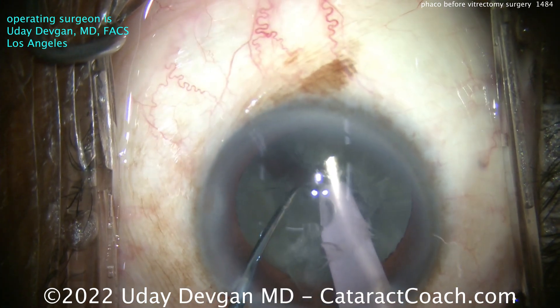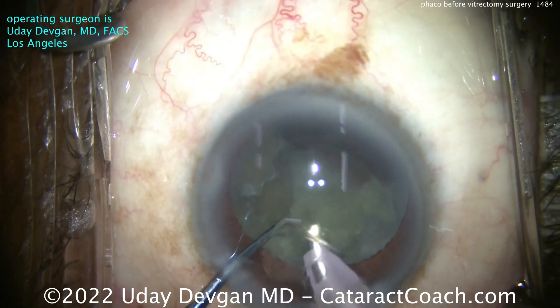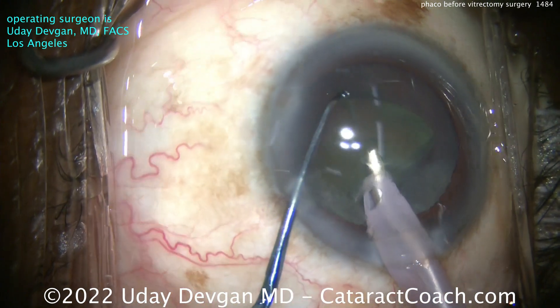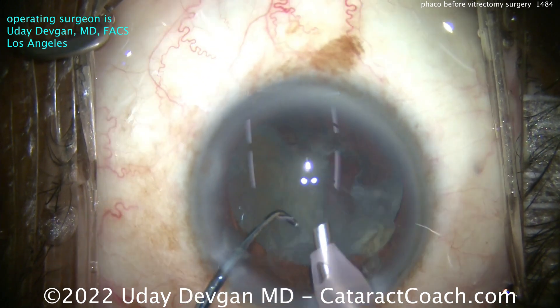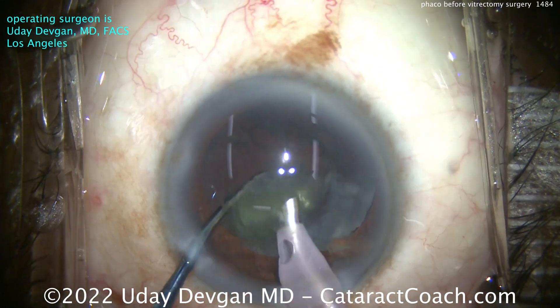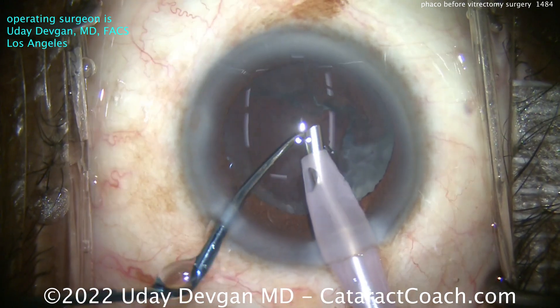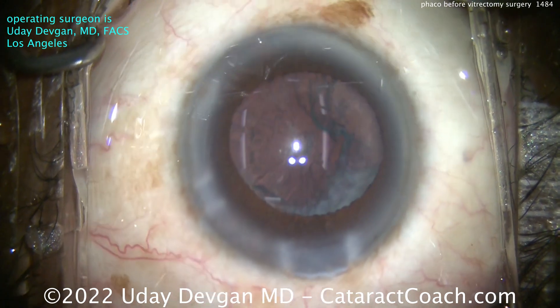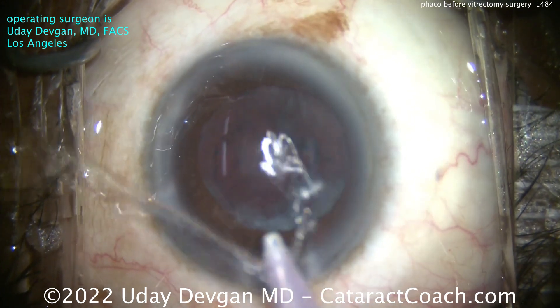Here we're going to chop the lens in half, bring up each half and emulsify it. The rest of the cataract is pretty routine. You want to get a single-piece or three-piece lens in the eye — either one should be a reasonable choice. When you have macular pathology or a compromised macula, you want to put in a monofocal lens. In this case we're aiming for about plano, putting that monofocal lens in the capsular bag. We also want to do a good job of really cleaning up the capsular bag so that when the retina surgeon looks at the retinal periphery, there are no issues impeding the view. There's a little epinuclear shell still in the back — we'll get that all out with the I/A probe.